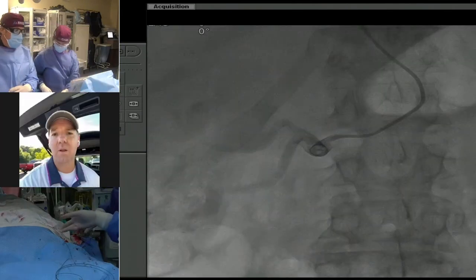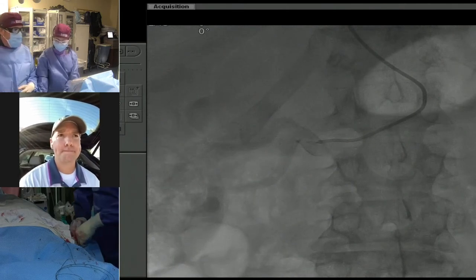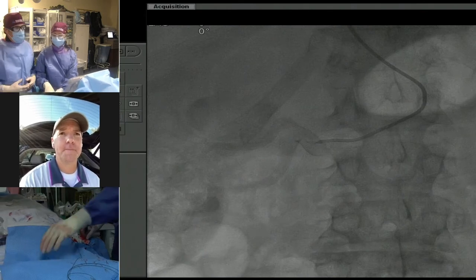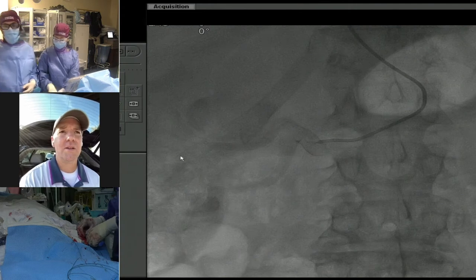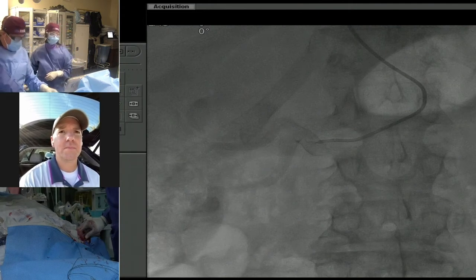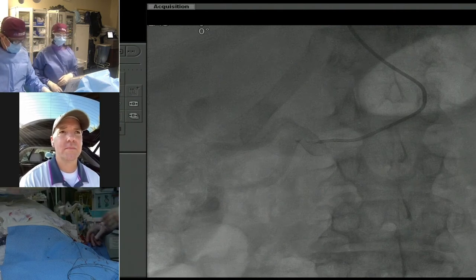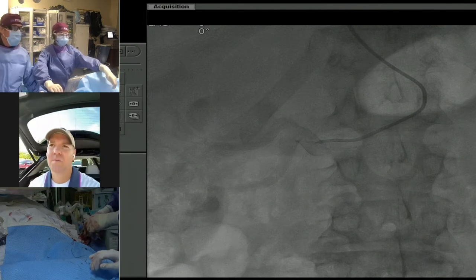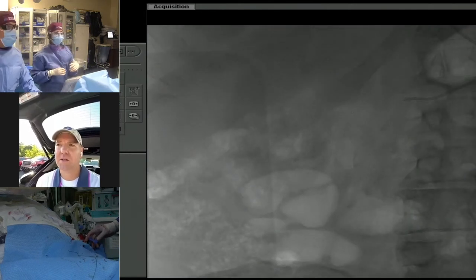If I'm going to ablate a T1B, I almost always embolize it. But this is a large T1A, and so what I prefer to do is just ablate them if I can. But I found that with these larger lesions, you tend to have more endophytic tumors that are trickier to ablate. When he came in a year ago to do that biopsy, we were actually planning on doing an ablation, and I decided not to do the ablation at that time because I was a little concerned about the complexity of it and the risk for him.